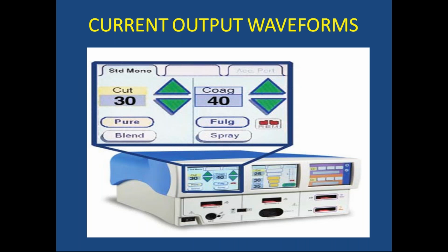So, this is the current output waveform, in which the cut and coagulation modes are present, where we monitor based upon the amount of current required for the tissue effect.